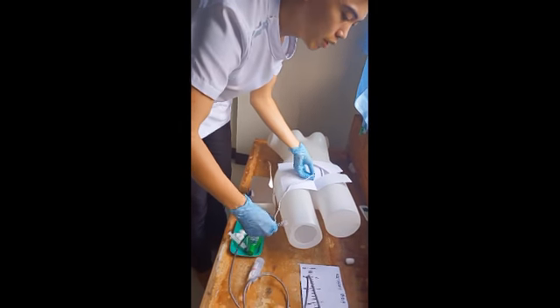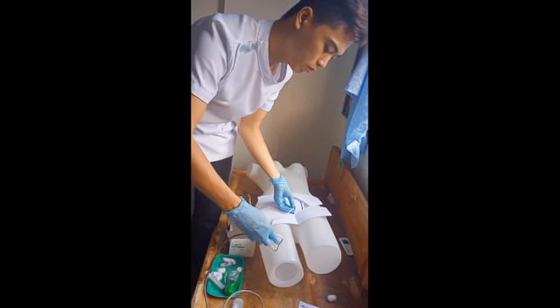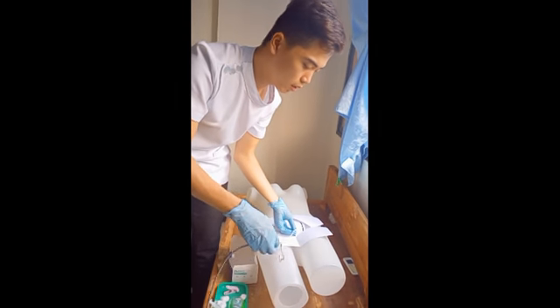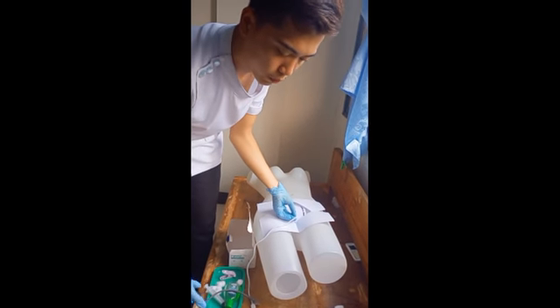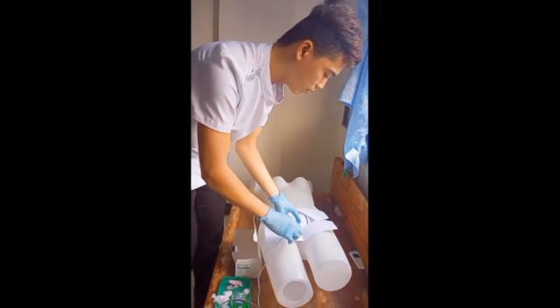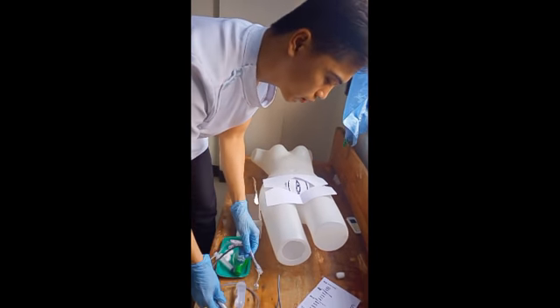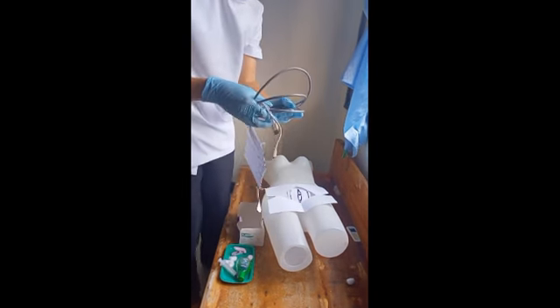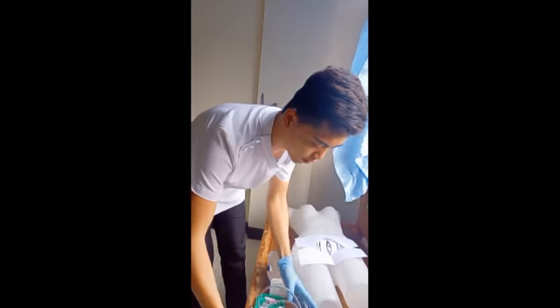So this urinary bag is used to collect the urine of the patient, and this is the tube. This is the tube that flows into the urinary bag. And the next is I'm going to arrange it and put this just like this, okay?